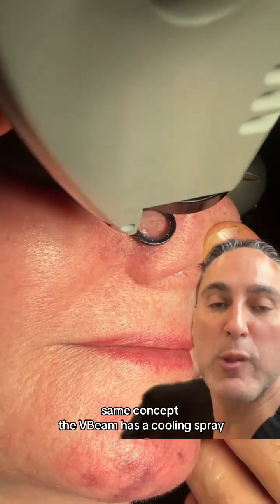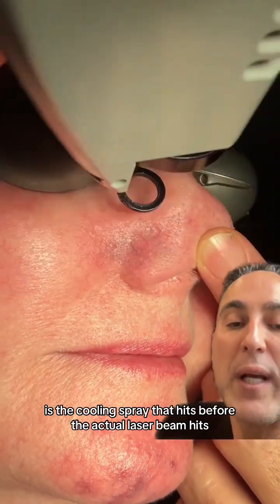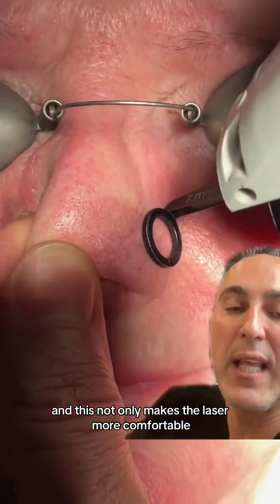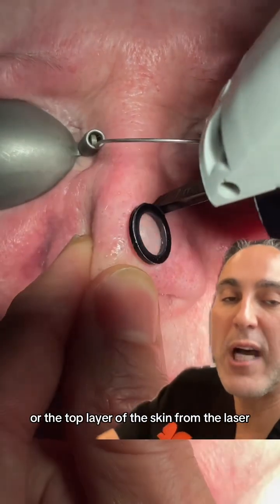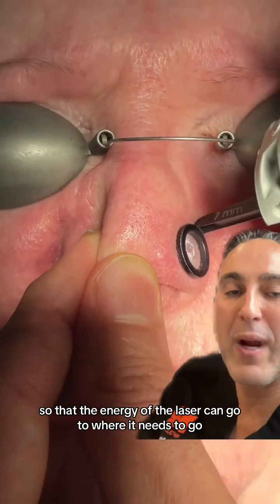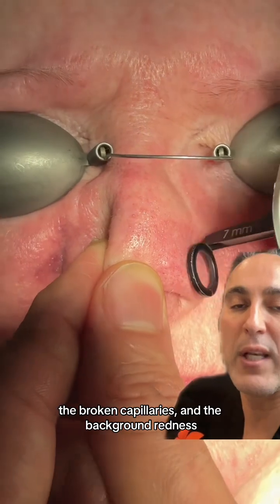The V-beam has a cooling spray, so that white thing that you see hitting is the cooling spray that hits before the actual laser beam. This not only makes the laser more comfortable, but it also protects the epidermis — the top layer of the skin — from the laser, so that the energy can go to where it needs to go: the blood vessels, the broken capillaries, and the background redness.